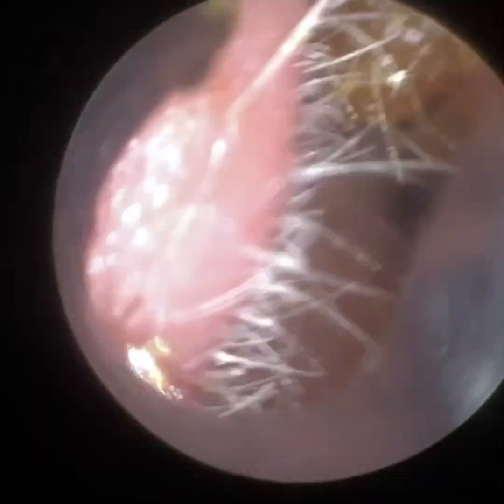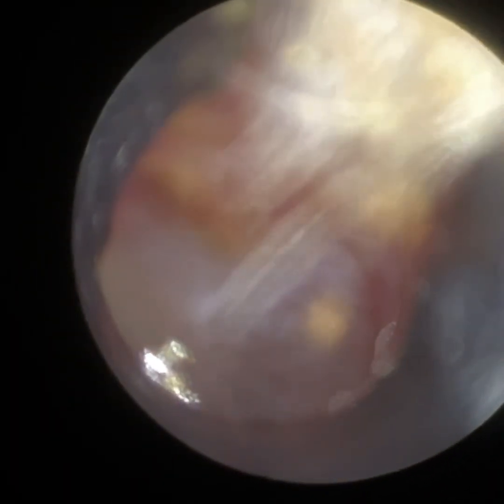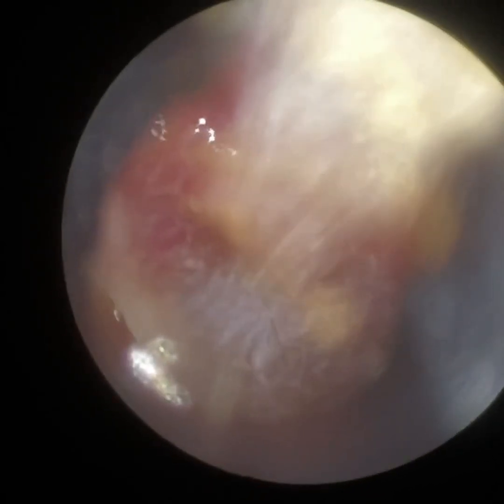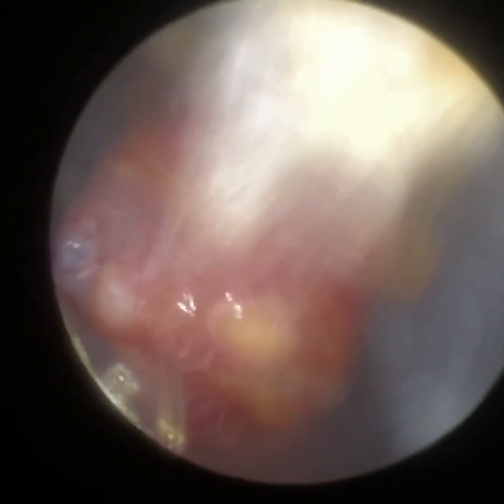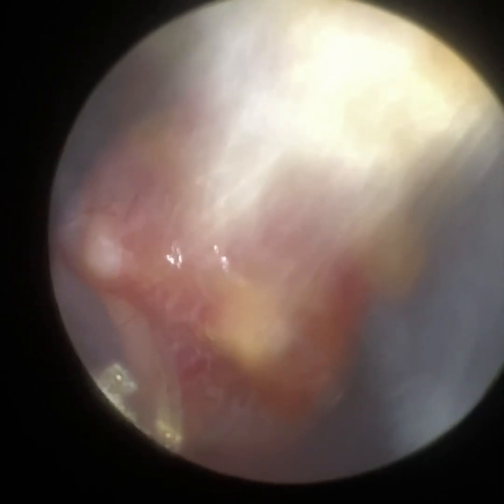You can see we've just adjusted it on the app — crystal clear view. The patient had been using a bit of drops in this ear, so although it didn't really soften the lateral part of the wax, some of the drops did settle deep in the ear. It must have penetrated through or drizzled through the gaps in the wax. Very narrow ear canal, but you can see the eardrum there — slightly vascularised, slightly retracted, but otherwise OK.